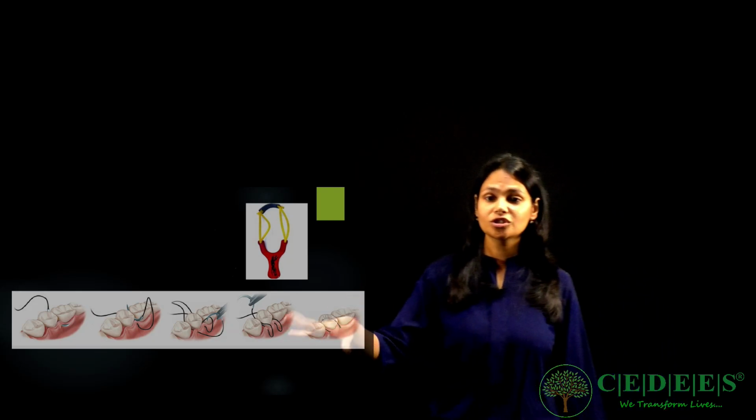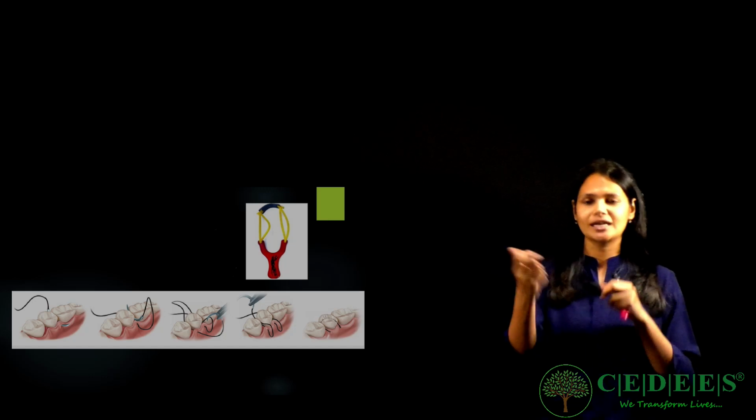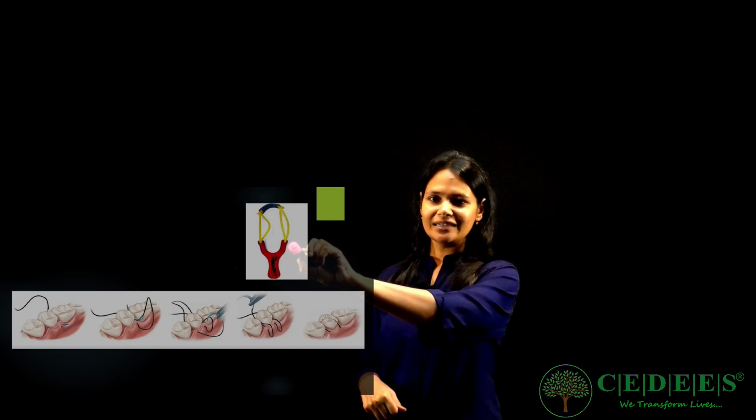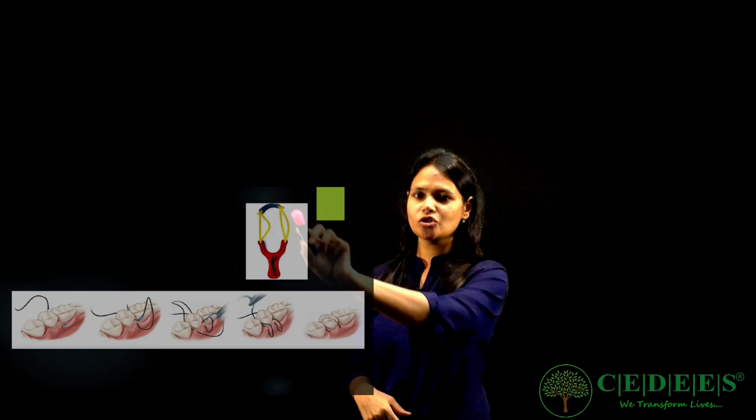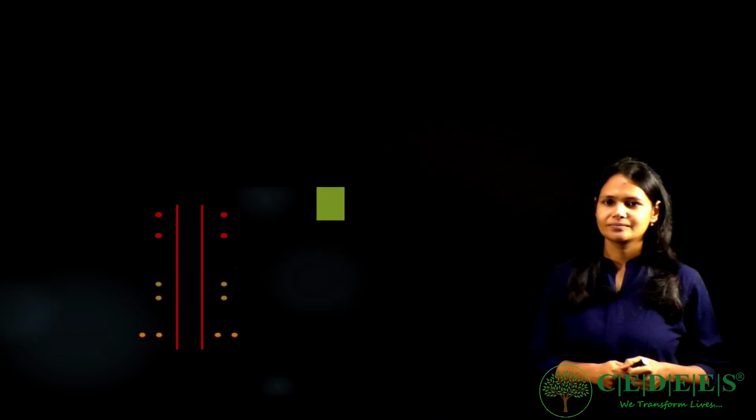Now this is the last suture, sling suture. When we were small, we have all played slingshots, right? Like a sling, it has 2 points of entry and the other side is totally free. So if you appreciate the picture over here, you pierce, you go around the tooth, come back, pierce again and close it up. I'll explain it to you in the next slide.